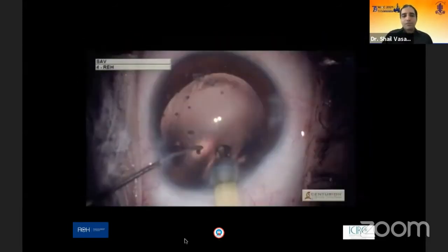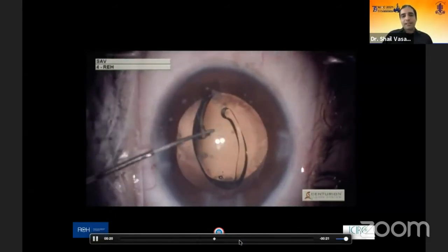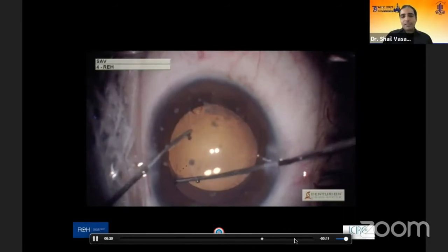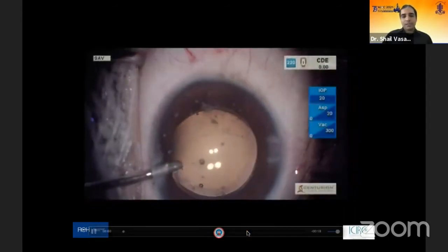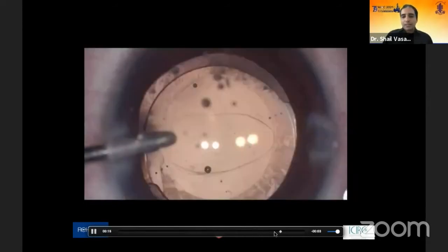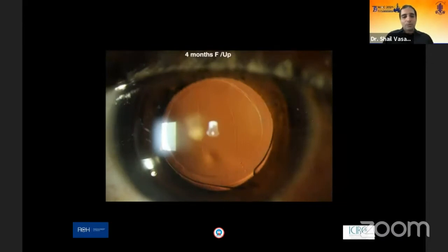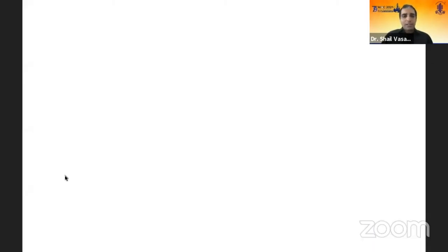We converted the rupture into a strong posterior capsulorhexis margin from both sides. With a strong margin established, we proceeded with a trifocal toric IOL in-the-bag. The postoperative stability of these IOLs is not a concern. At four months follow-up, the patient has strong anterior and posterior capsulorhexis with excellent outcomes. The role of femtosecond laser, particularly for posterior polar cataracts, is very useful in our practice and provides a safety advantage over routine cataract surgery.